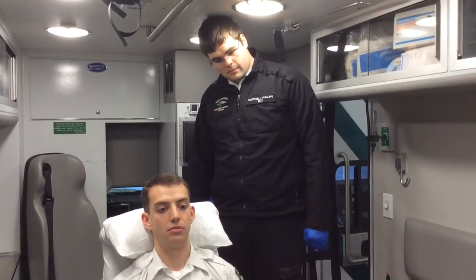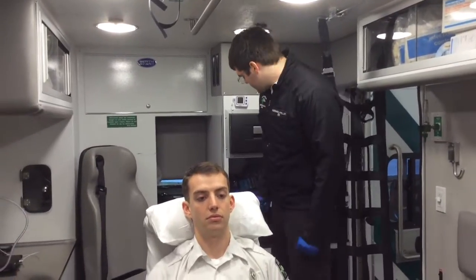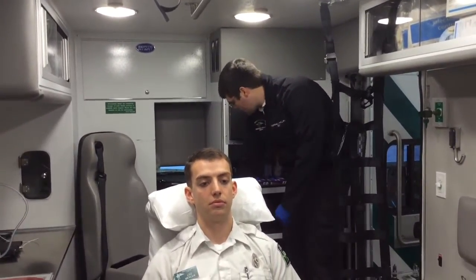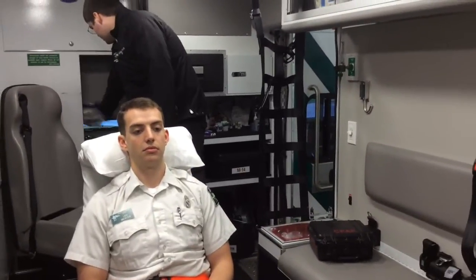Start by making sure BSI is observed, the scene is safe, and we have our personal protective equipment. The CPAP, mask, and hose are located here on the shelf.